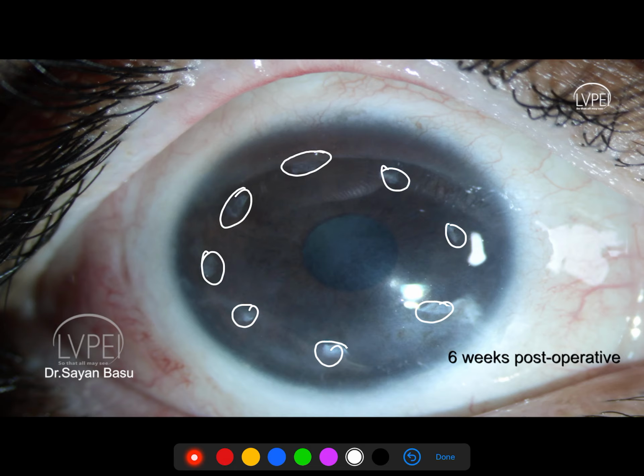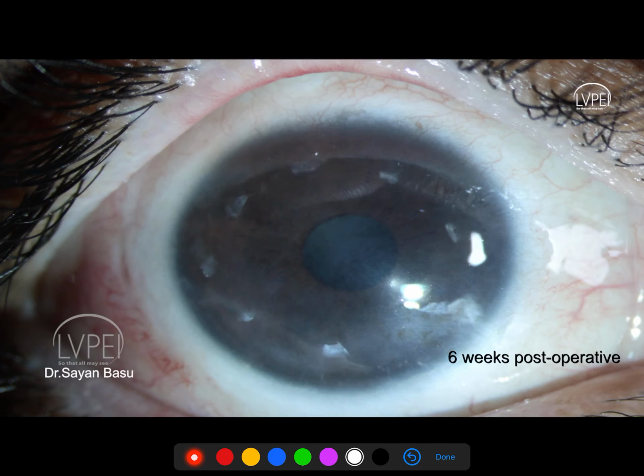And you can see the obvious improvement in the corneal clarity, and you can also see that the amniotic membrane here, the conj is still way back where we left the amniotic membrane, and you will see remodeling over time. You will see that the conj will move closer over time, and this will happen, but this is typically how it looks at 6 weeks.